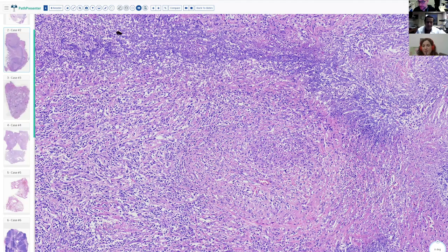And in real life, you'd probably still do the bug stains and everything, right? Yes. And I don't think medical doctors would trust that as much. If we say Wegener, they would try to prove it. It's not going to be only Wegener because the pathologist says so, but it's a bad mistake to make. They'll still do serology and everything and rule out other causes.